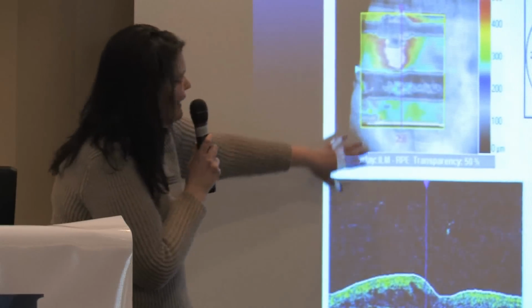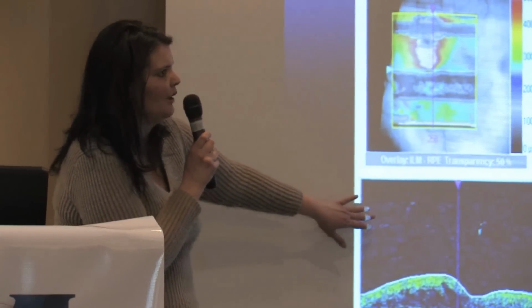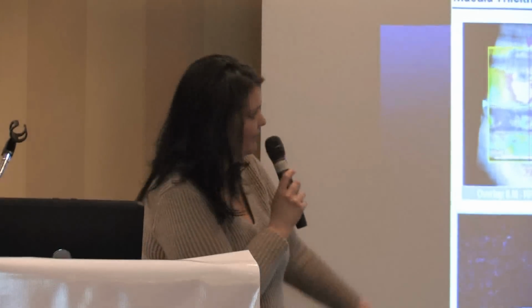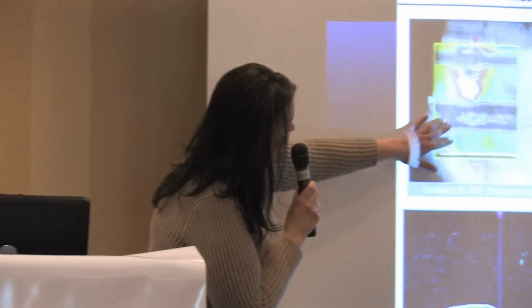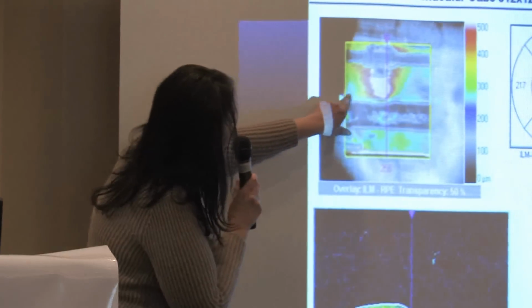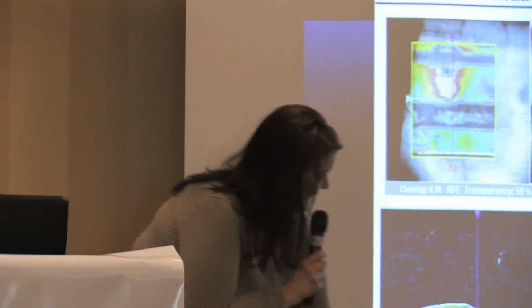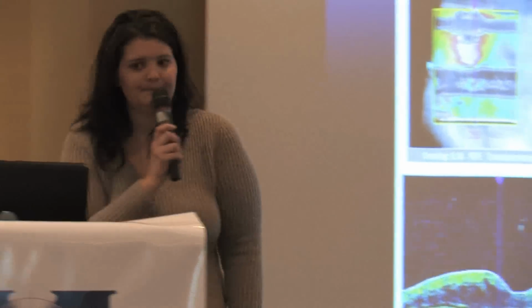So we'll save the scan, but we might say, okay, we're going to repeat the scan because we want to get the best information possible to help you. So we might have you sit back, blink a few times, and then we'll repeat the scan. We can use it and we can move the points and do it again, but it really is not a good quality scan.